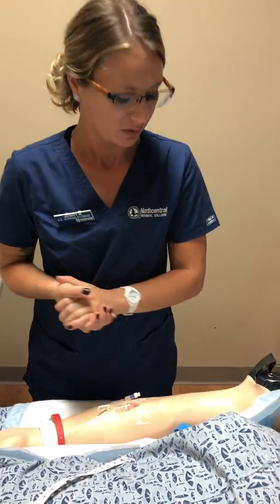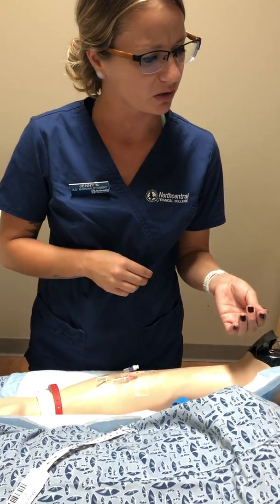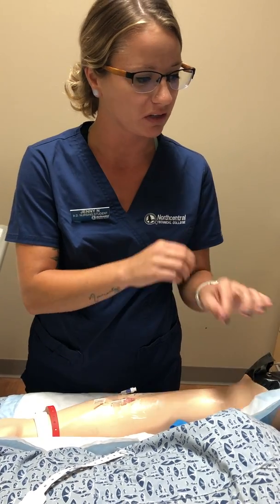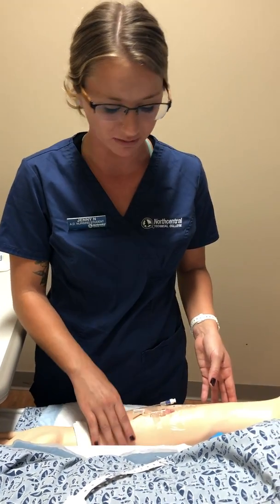All right. So the IV is in place, Mary. I just want to let you know that it was a needle to insert it, but it's just a catheter that's in your arm. So it's nice and flexible. So the needle is out. It's just the flexible catheter in your arm now. And that's for IV fluids and giving you medications through your veins.